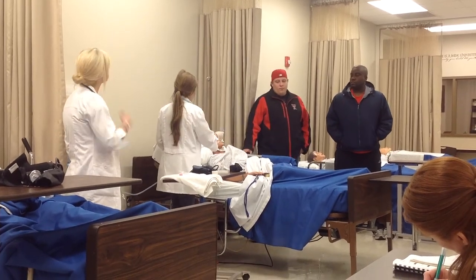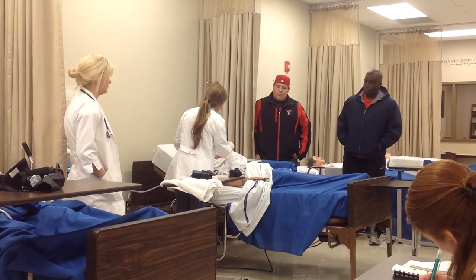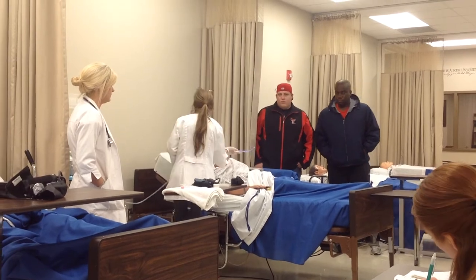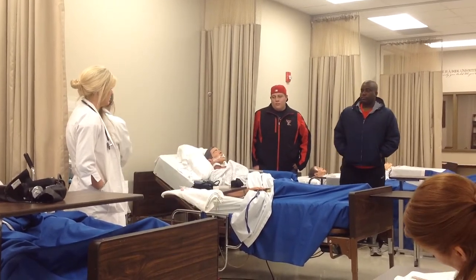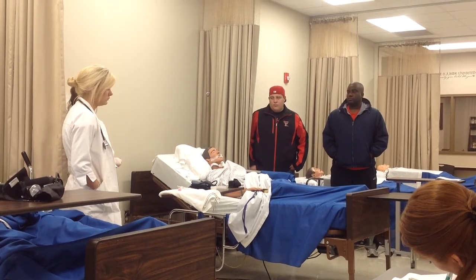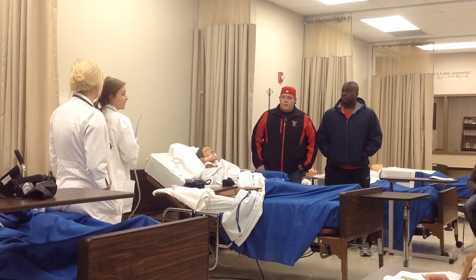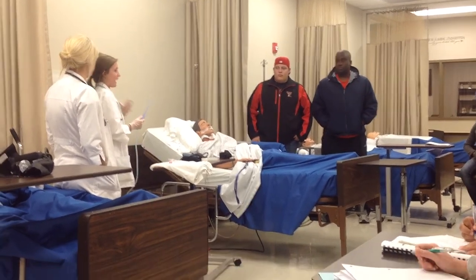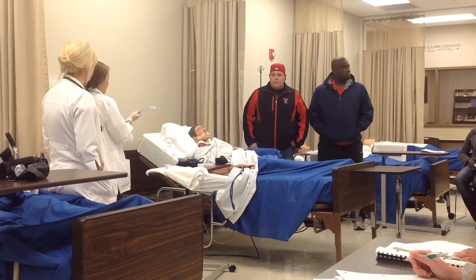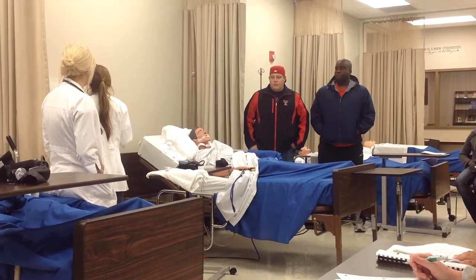Then you're going to insert it into the mouth. You're going to suction out all that you can. You don't want to leave it in there for a really long time, but get a good amount out. Then you're going to rinse it again, and put a piece of tape with name, date, time, initials on it. That's for your intakes and outputs, because that's what's coming out of the secretions. After you suction, you're going to keep this in a safe place because you're going to have to keep doing it.